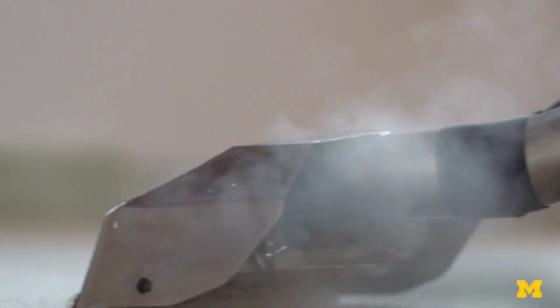Here, potentially, you have this device that you go in, it looks like a vacuum cleaner, and you disinfect the fabric, the seat, the floor, everything. We would like to see it as a means to just decontaminate wherever you need.